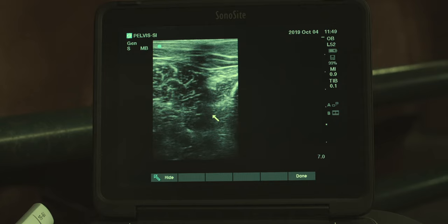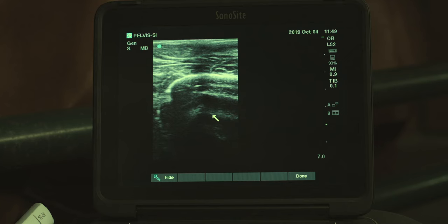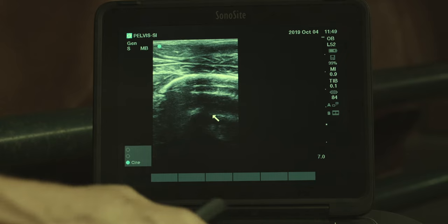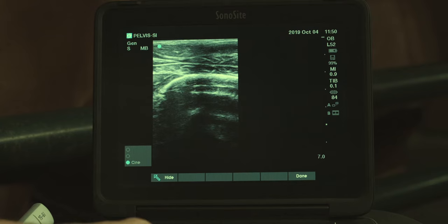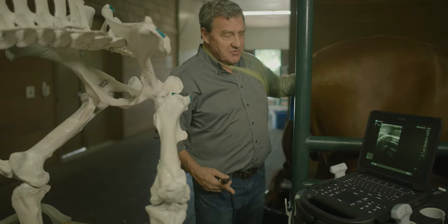You don't have any bone reflection, and then as I move back you're going to see the ischium table, the cranial aspect. My probe position is here on the specimen, and if you look on the screen I can freeze this image and move our arrow up. This is the cranial aspect of the ischium table here, curving down into the obturator foramen.